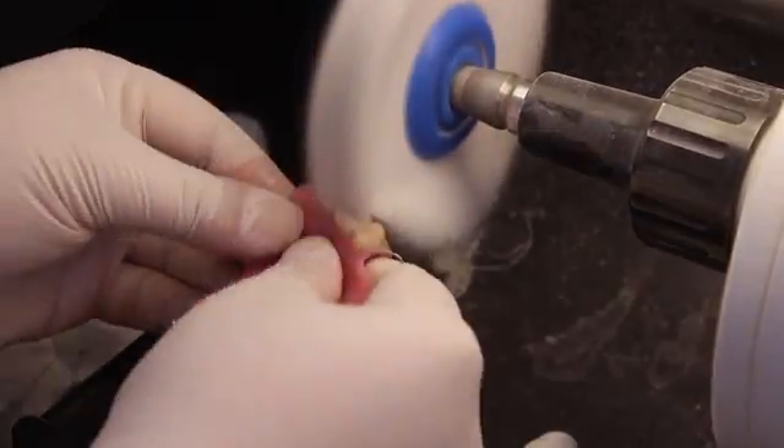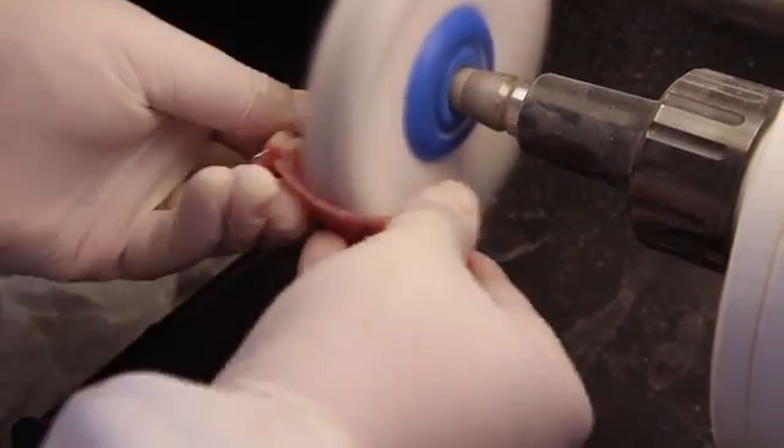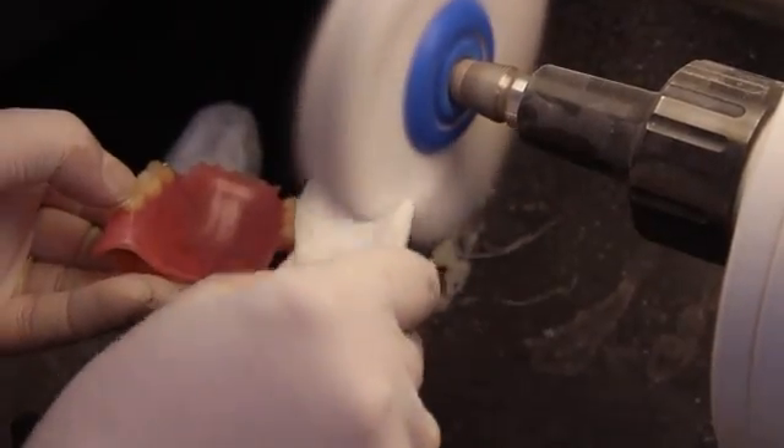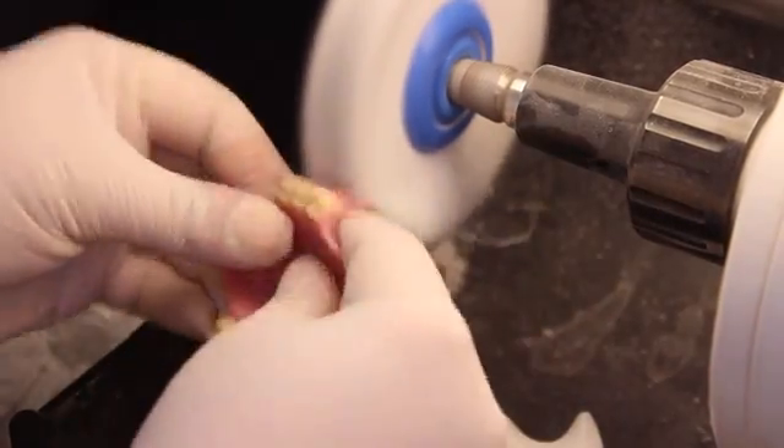Note that as you are polishing the acrylic resin, you need to hold it with both hands against the wheel. Minimal pressure should be applied. Be careful not to over-polish, because this might thin out the acrylic material and weaken the denture base.